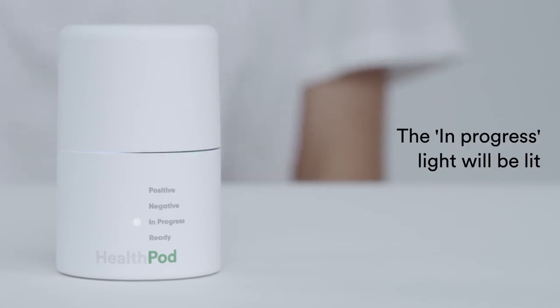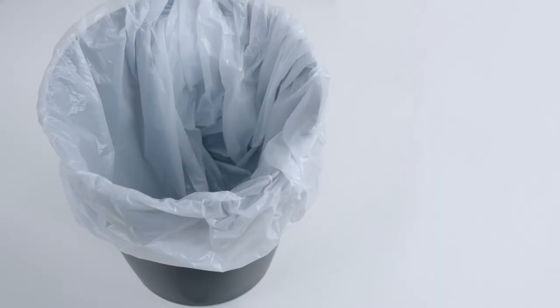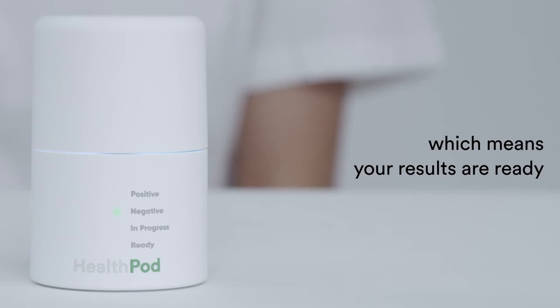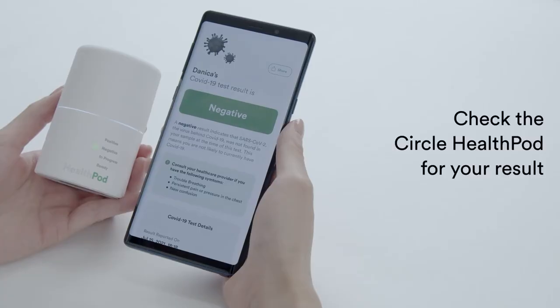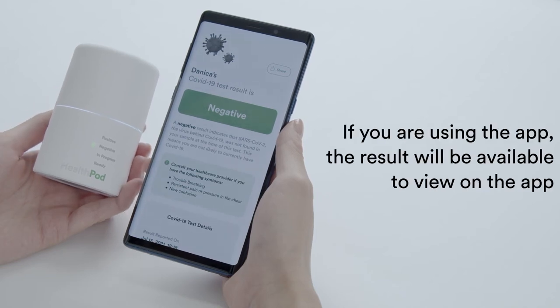The in-progress lights will be lit and the light ring will rotate. The lights will change in around 20 minutes, which means your results are ready. Check the Circle HealthPod for your result. If you are using the app, the results will be available to view on the app.